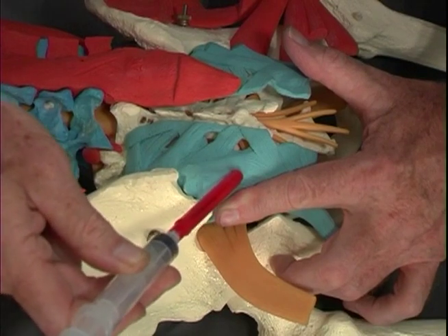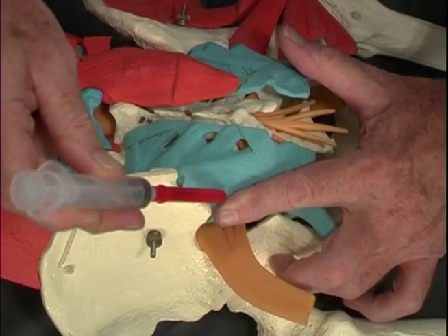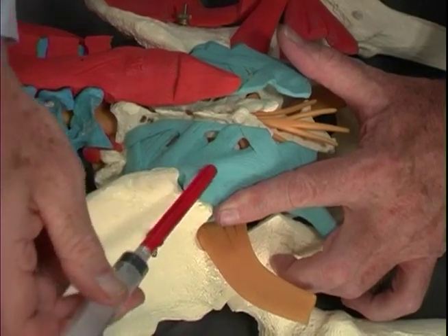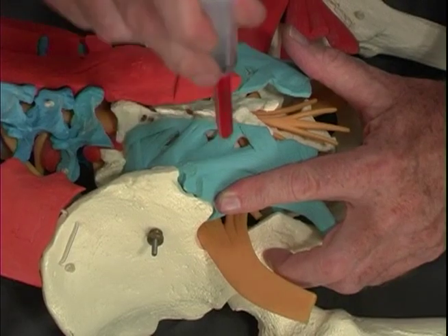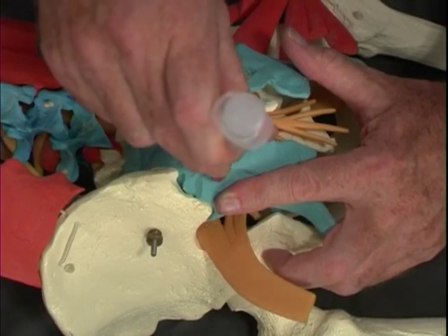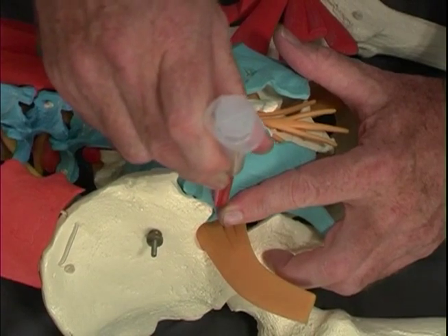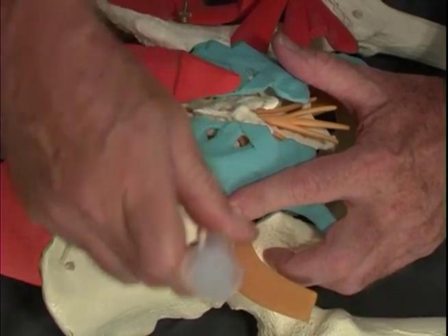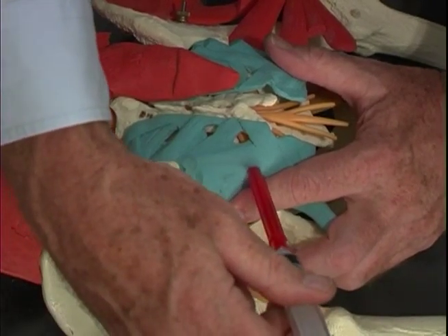If we miss it, we may be too far over, or we may be sliding over the top of it. So what we can do is feel where the edge is, and then come straight down with our needle until we hit the edge, and then walk off in this direction until our needle drops off, and then orient our needle onto the side of the sacrum to hit that point.